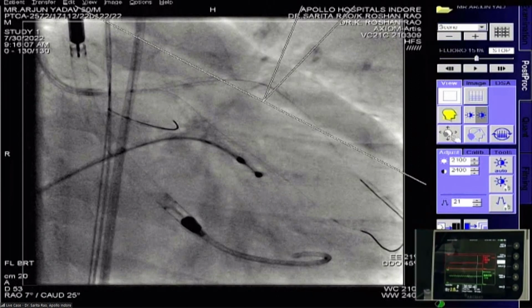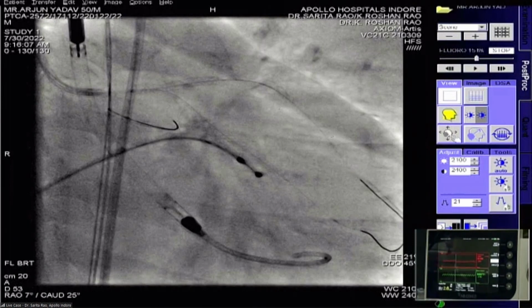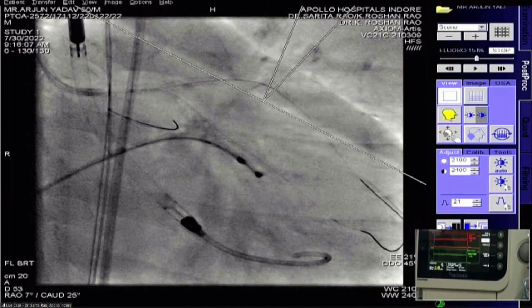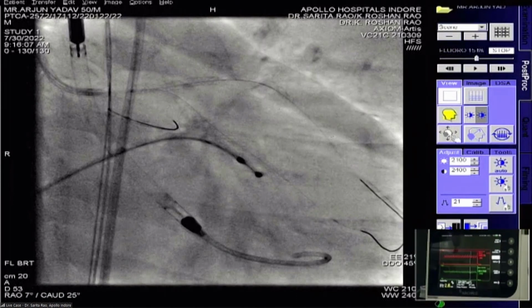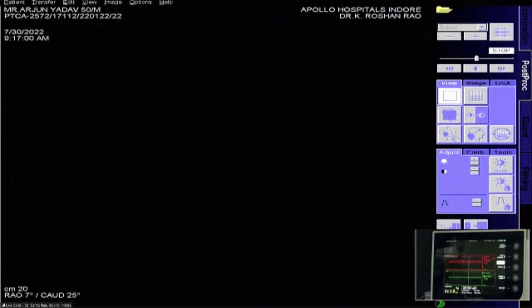Yeah, Dr. Vikas, cardiac output is still good on the 2.8, I think, or 2.6. Can you make the impeller screen bigger than the fluoro? Switch the screens if possible. I think she's just seeing that the patient result is good. Okay, the pressures have picked up again. Pressures are now okay. We had a transient drop at that time.